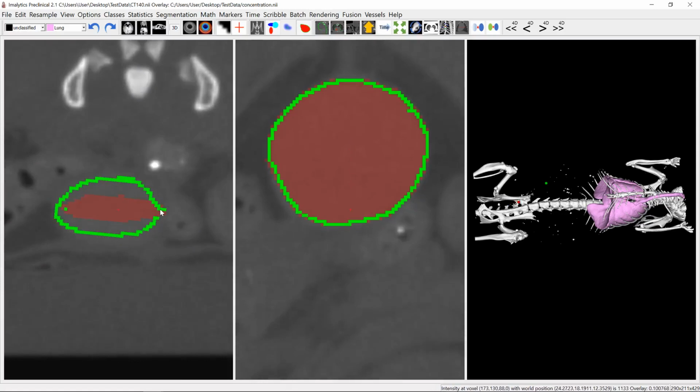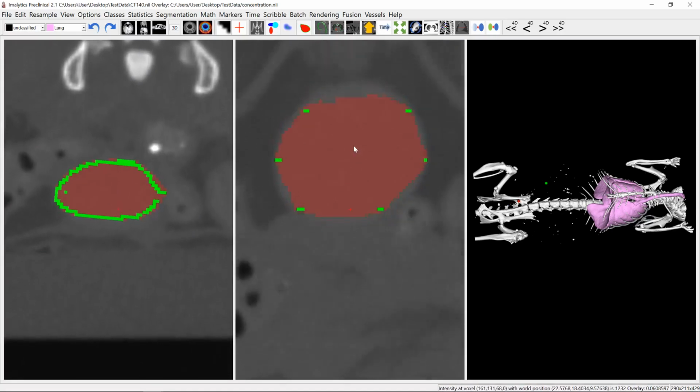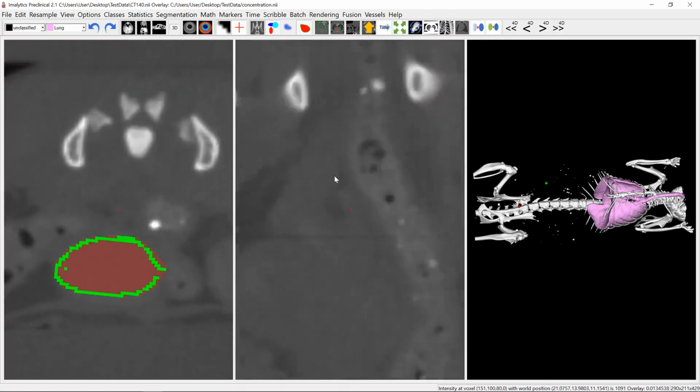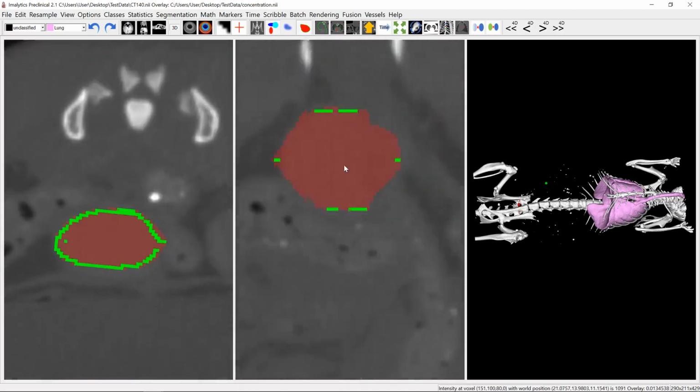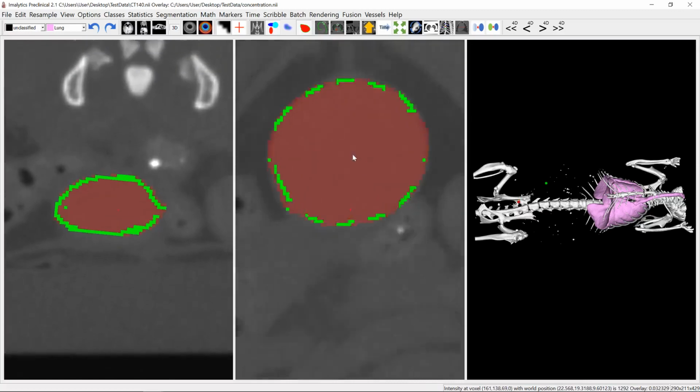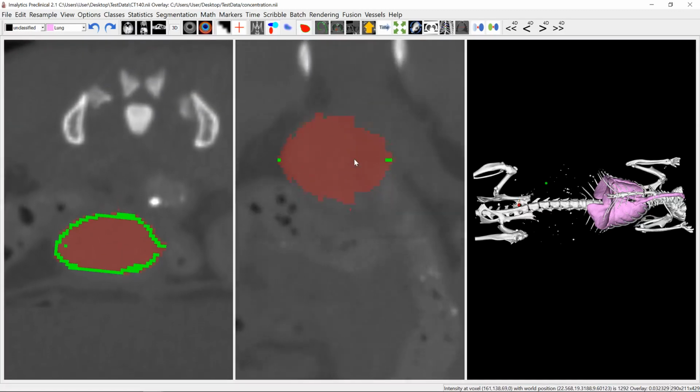So the scribbles are providing a wireframe, and F3 fills that wireframe. It's like surrounding it with a kitchen foil, and then filling that kitchen foil. And usually around 10 scribbles are sufficient. So let's have a look here.